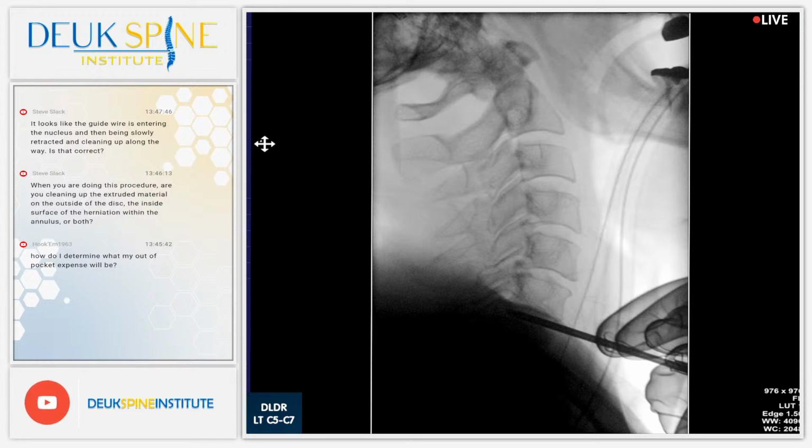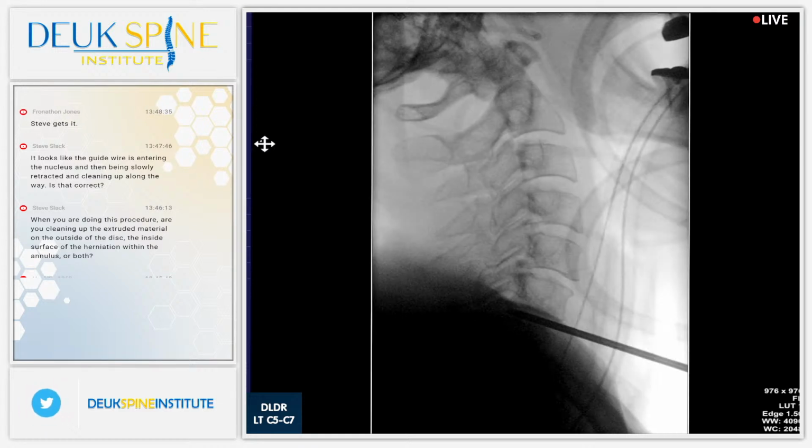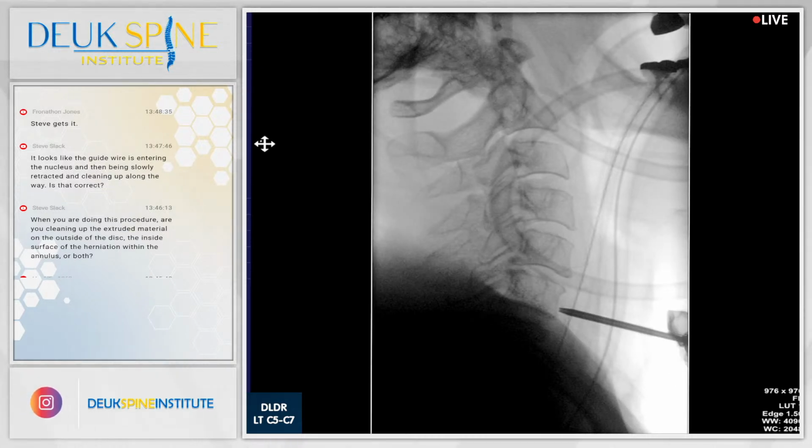Now you can see we had no bleeding. We've literally lost 1 drop of blood the whole surgery. So this is also bloodless surgery. All right, I'm going to move up out of the disc, and I'm going to move north. Keep the head straight. You don't want the head rotated. Shot. All right, you see I'm almost out of the disc? Yes, and we do. I am now out. I could feel it. This part I created, the first in the world to do it. Now we've lost a little bit more blood. Not a big deal. Looks like 5 drops. That's because we're sliding along the ALL, anterior longitudinal ligament.